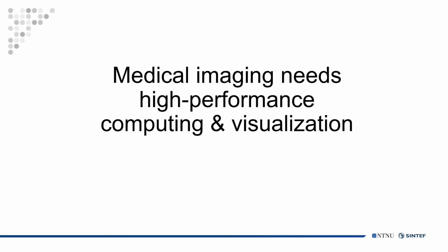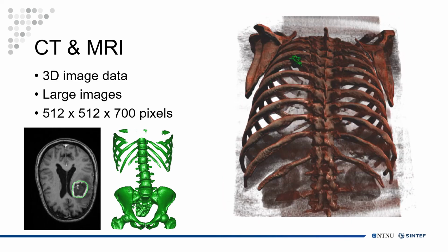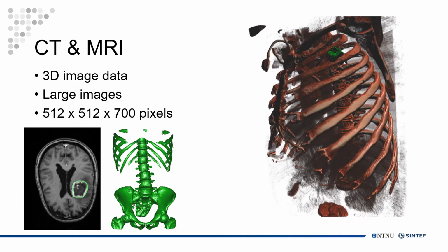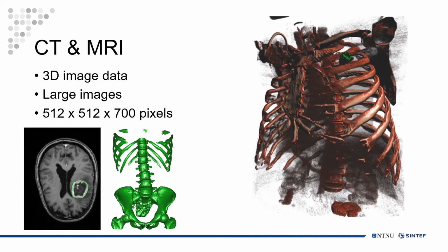First of all, medical imaging needs high-performance computing and visualization. And to show you why, I will demonstrate some of the data we have in medical imaging. Images acquired in computed tomography and magnetic resonance imaging are essentially 3D images. And here are some examples.